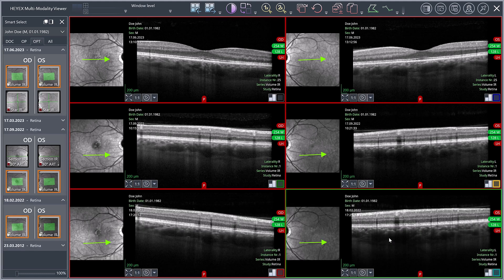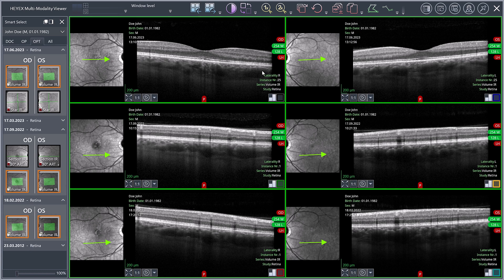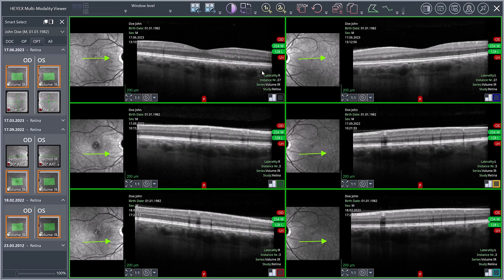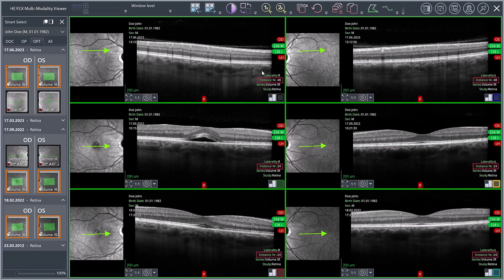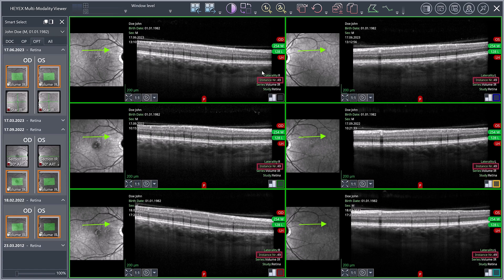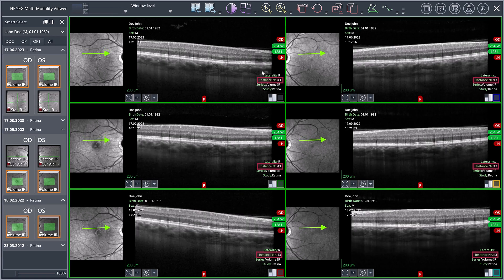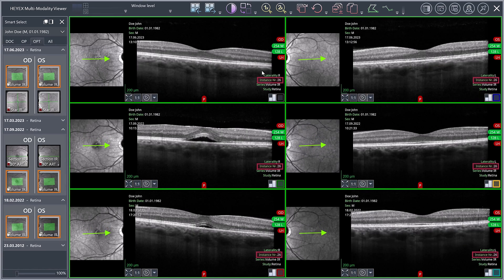To scroll through all OCT scans simultaneously, hold down the control key and click the red framed inactive viewports again to activate them. Scrolling causes the scan lines in all marked images to move simultaneously. To ensure that the scan lines are in the same position, scroll up or down until all scan lines are at the top or bottom edge of the image and are aligned. The OCT scans can now be compared.